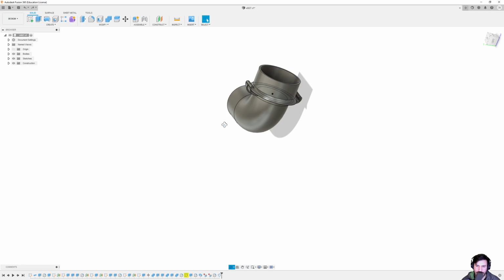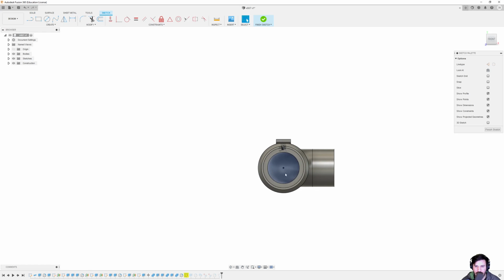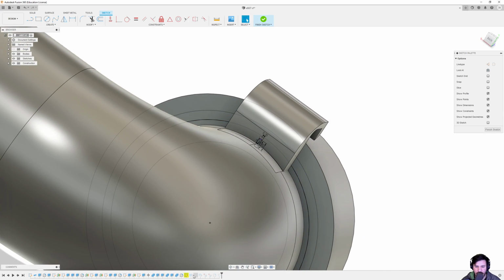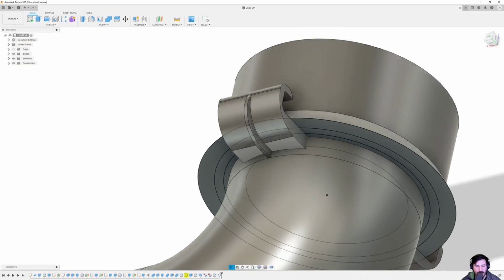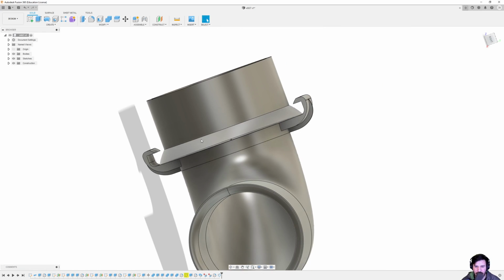But yeah, I kind of wanted to step through the timeline. There are some errors. This sketch right here never really got used for anything. This was initially one of our, if you look at the end piece, it's this. It probably has to do something with that. Maybe the plane doesn't exist, but it's still in the correct position because it didn't change. So there are some mistakes that are not perfect. This isn't really made to be a guide, it's just more of a little bit of detail here.